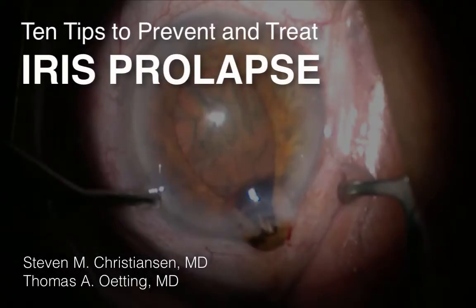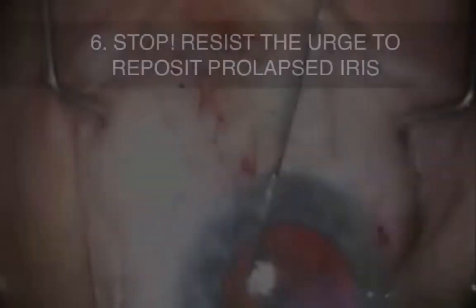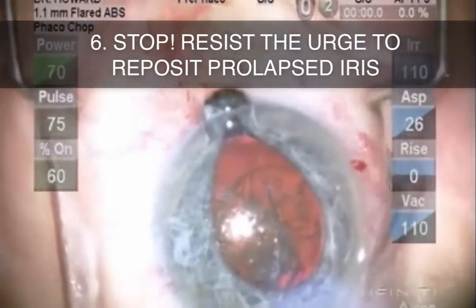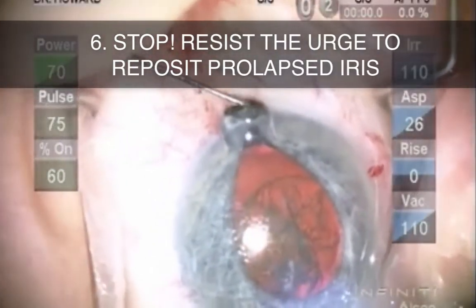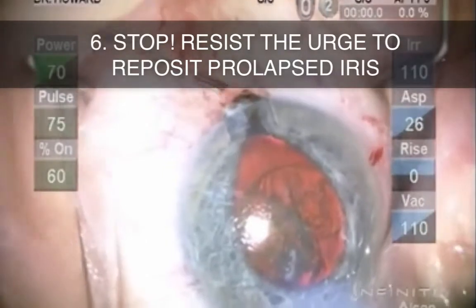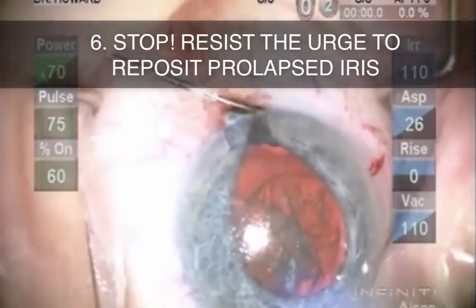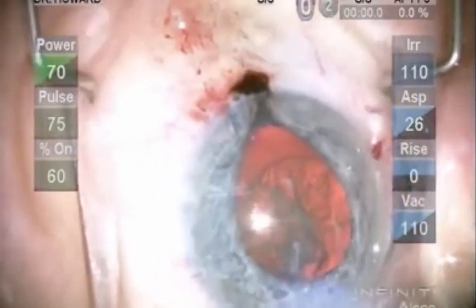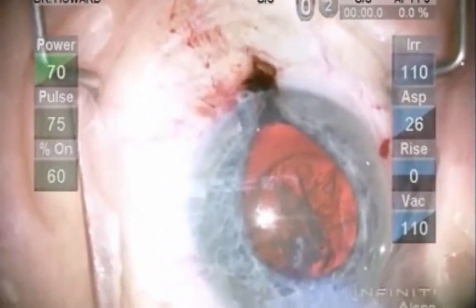Now let's talk about intraoperative treatment of iris prolapse. As soon as iris prolapse occurs, the knee-jerk reaction is to want to immediately push the iris back into the eye. It can be tough to overcome this urge, but realize that it is usually in stuffing the iris back in that pigment is permanently lost from the posterior iris. Also, rarely is this actually effective.